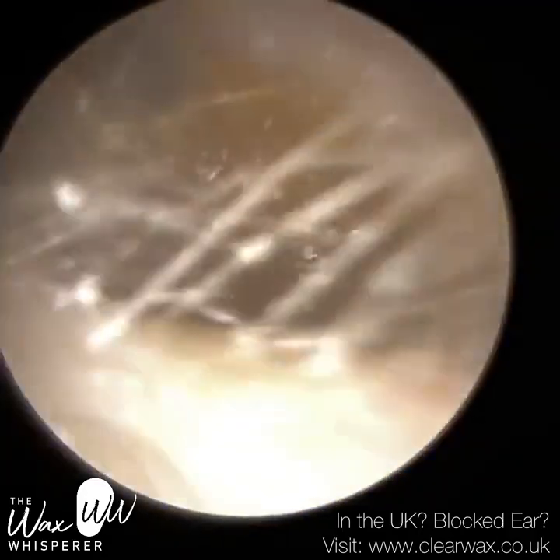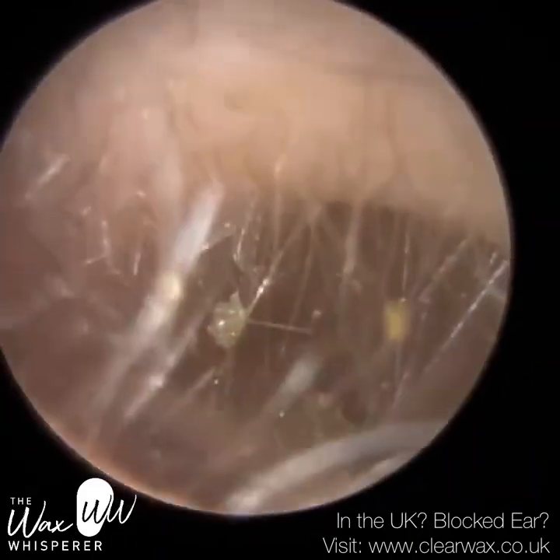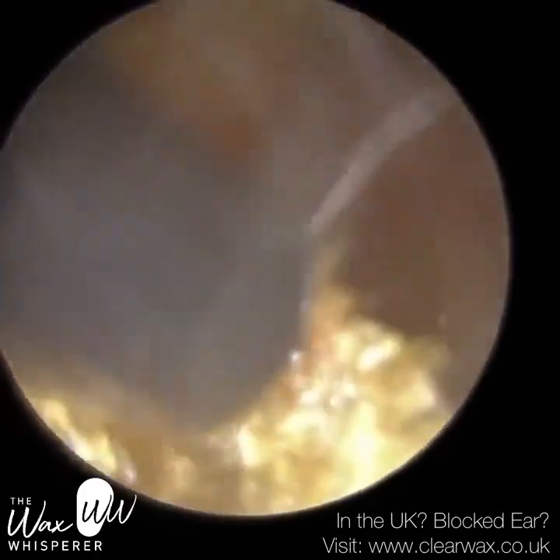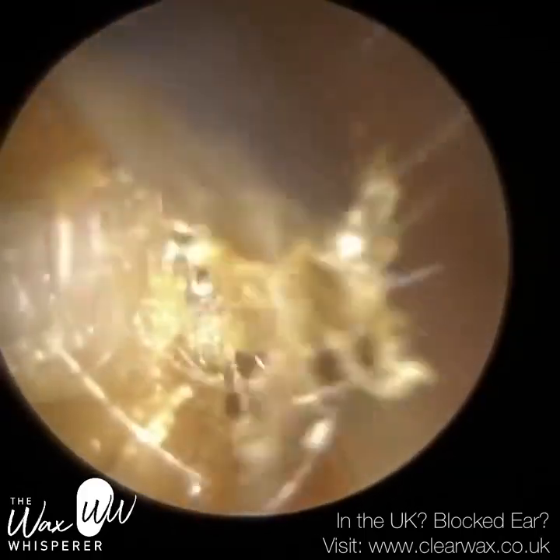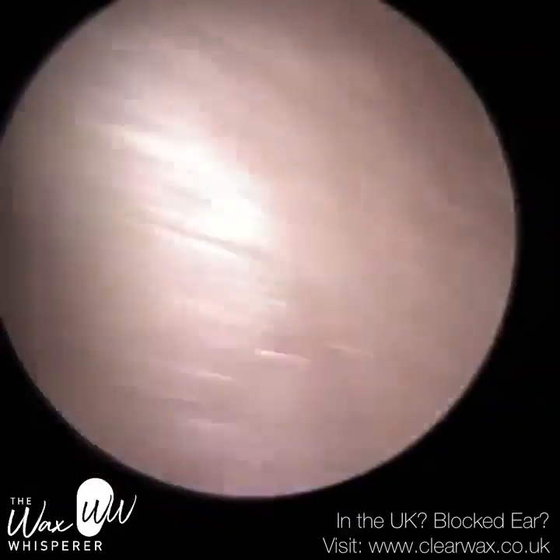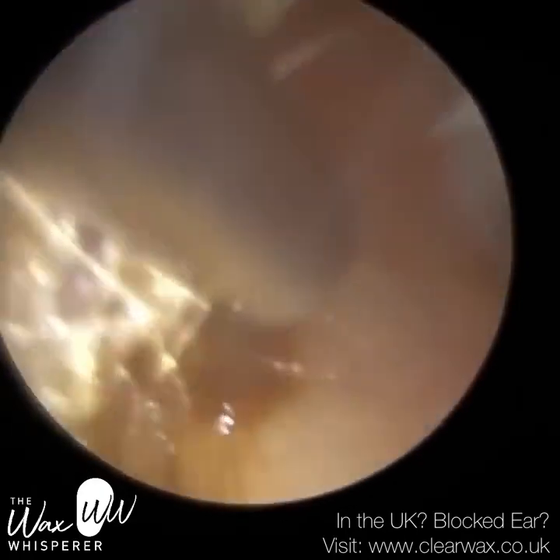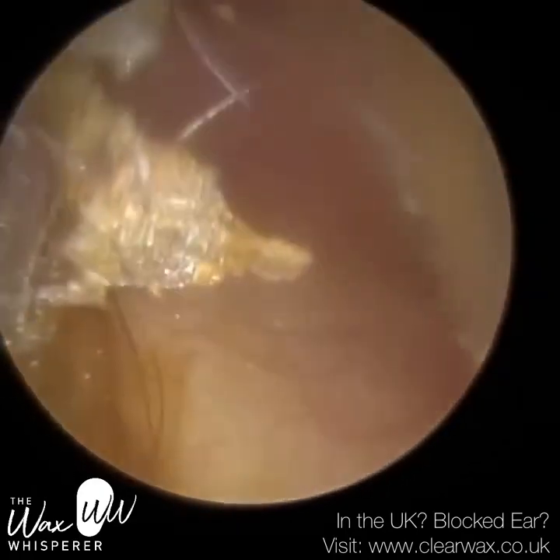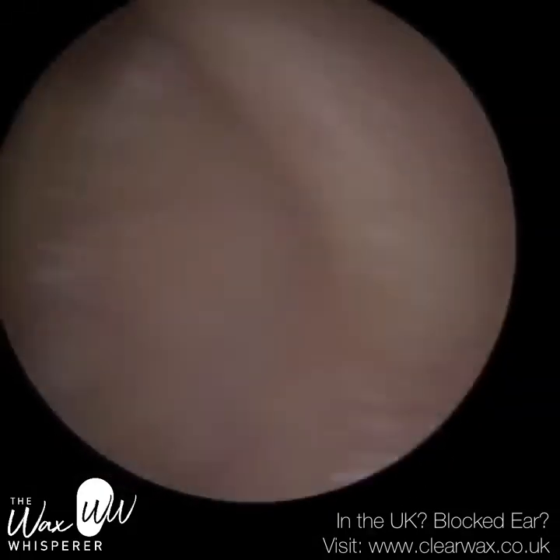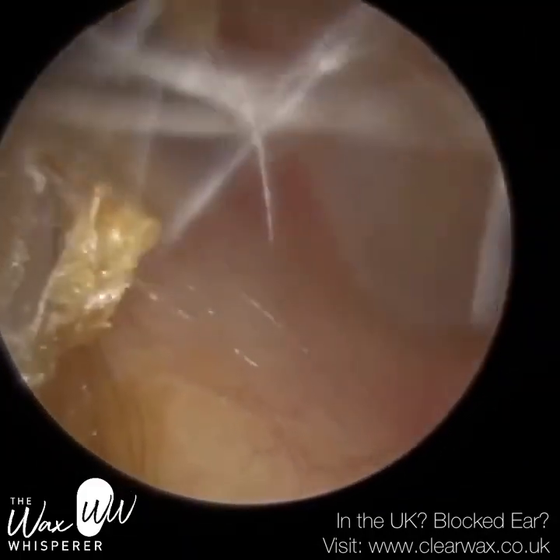So there's a couple of schools of thoughts and suggestions. I suspect there's validity in both. But yes, that's why it's called microsuction, if anyone wondered. And I'm now just using a fine end suction probe. So this suction probe that I'm using now is even narrower and smaller than the original one that I was using, called the Zollner suction probe.